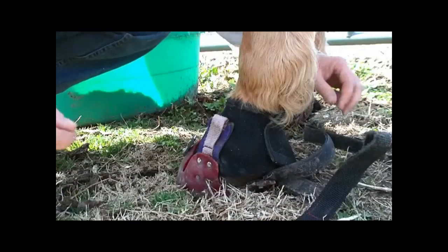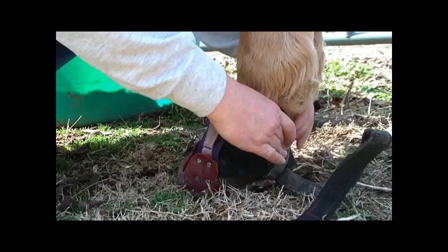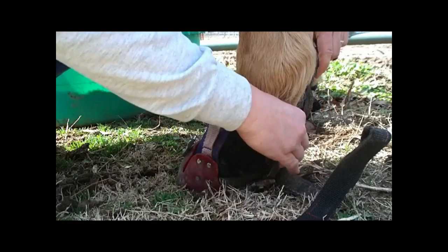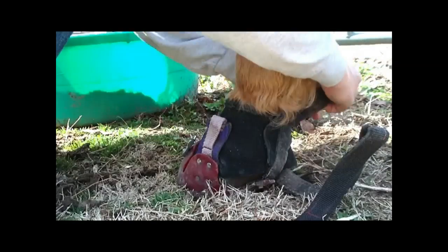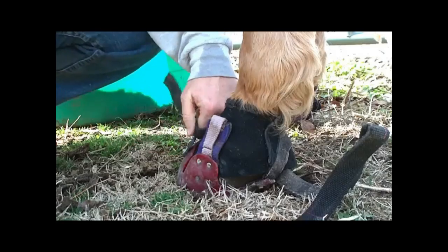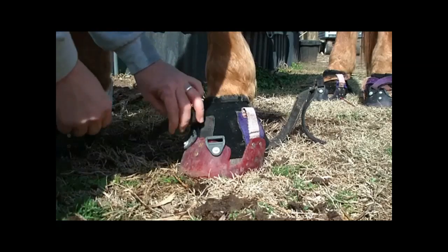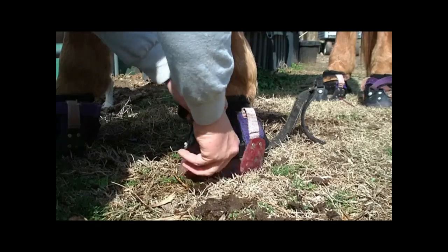Take your inside strap, lay it up over the heel bulb — do not put it low. Bring it up almost over the center of the heel bulb, then pass the strap through the side loop.